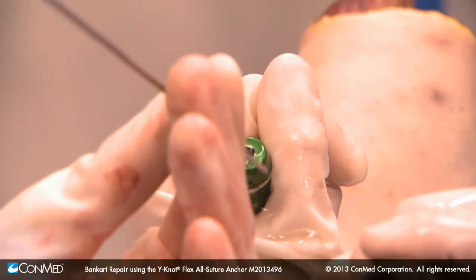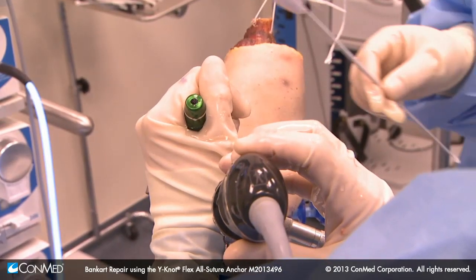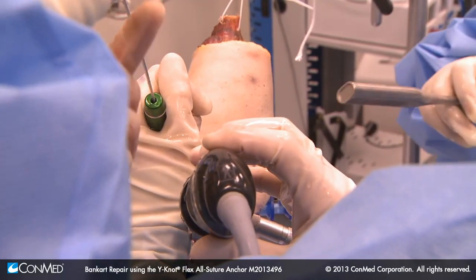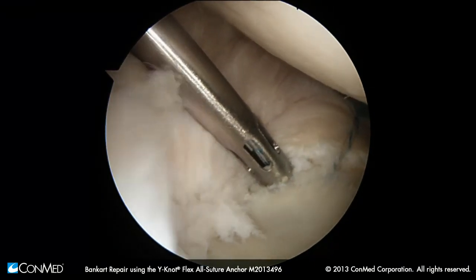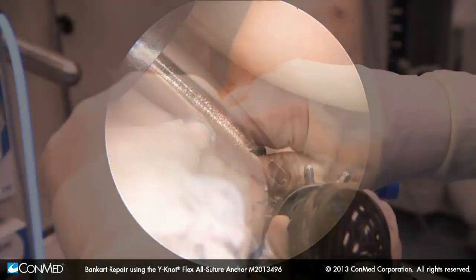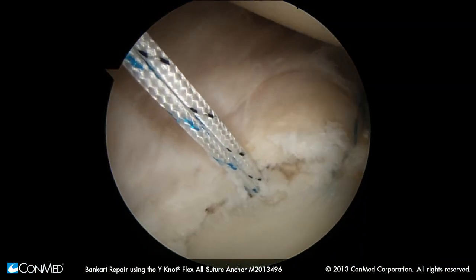We're going to put our next anchor in, so we need the drill for the 1.8. At this point, my left hand is doing the procedure. Nobody is going to distract me or get me to move that left hand at all — just staring at the screen. It'll bottom out. I like that. We'll put our snap here. We'll pull on the outside — pulling pretty good now. We can pull this whole specimen and it's pretty well set down there. Now we've got a double-loaded suture anchor in.